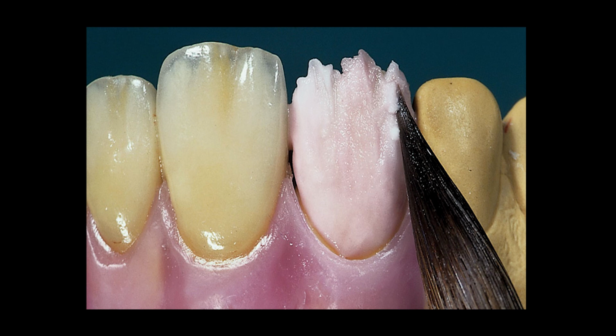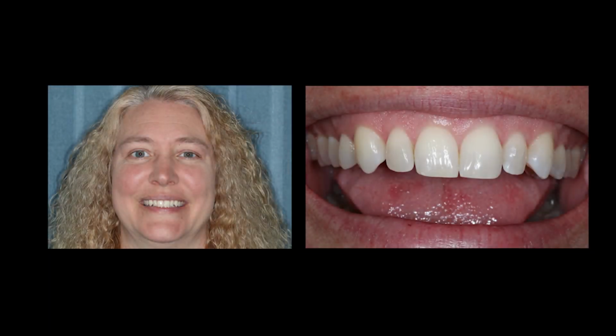Now let's talk about some other photos. The other reason that investment into a good SLR camera would be just good documentation. Now we're talking about your hygienists that are listening. Hygiene, to be able to document cases when a new patient walks in the door and to be able to pull this and put it into case records that maybe 5 or 10 years down the road, you pull those old photos up and maybe you show the patient when they first started to meet with you at some of the wear that's happened over the next 10 years, or where they were versus where they are today.